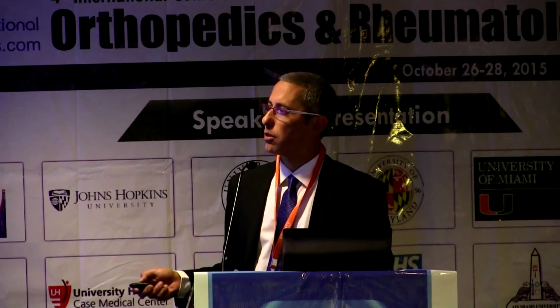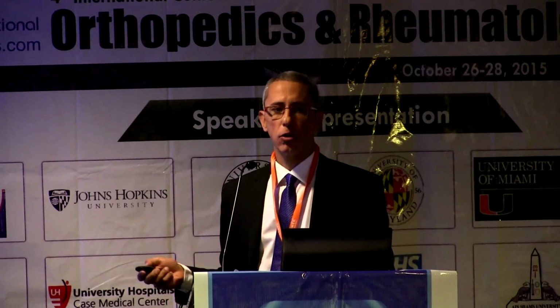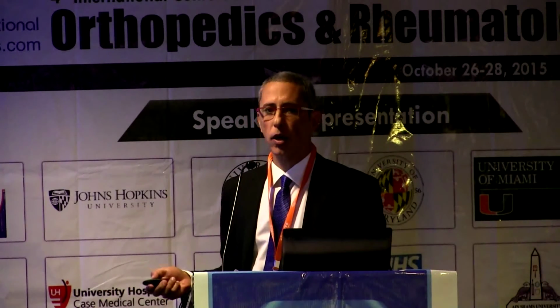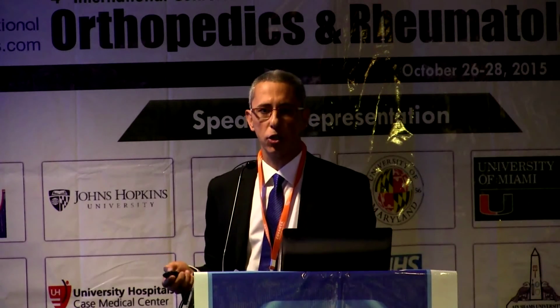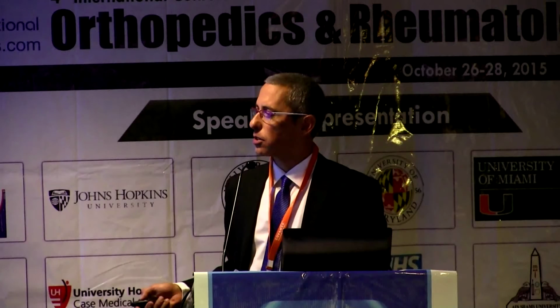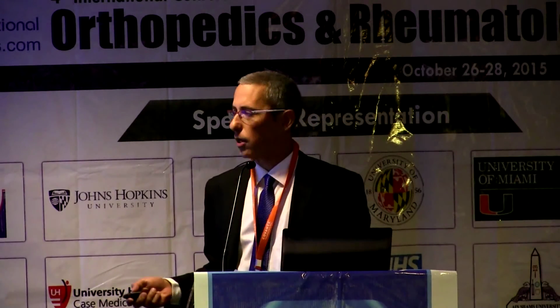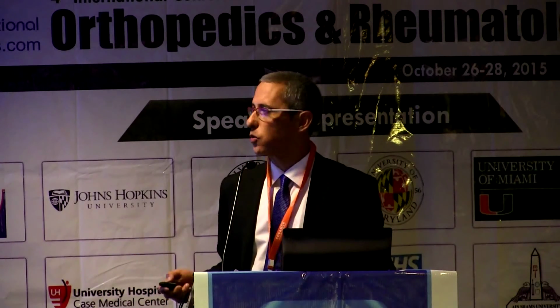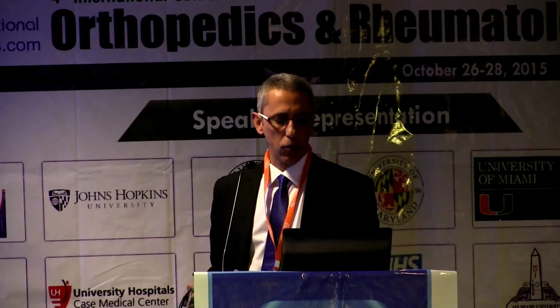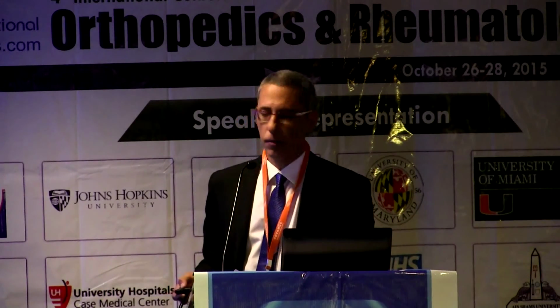So our clinical indication at the moment is irreparable rotator cuff tear. All patients that cannot have a total shoulder replacement, like patients that are too sick to have general anesthesia, or patients that are reluctant to go through a long rehabilitation and want to go back to work. So for me, the ideal patient is a patient that can lift his arm and has a lot of pain, in order to reduce the pain. Of course, we don't do it on an osteoarthritic patient or a patient with infection or glenohumeral instability.